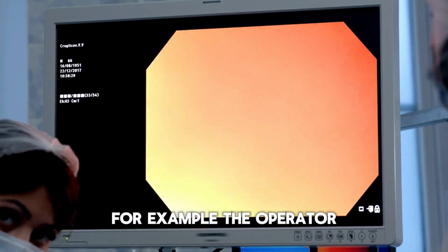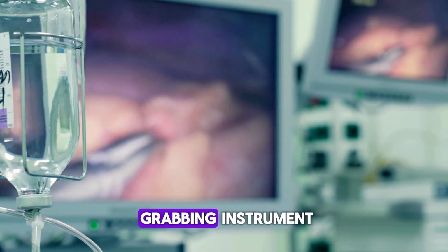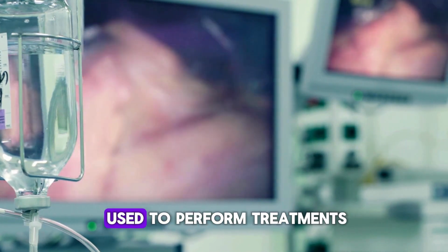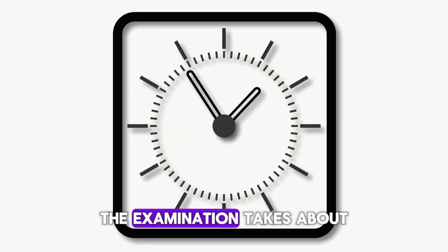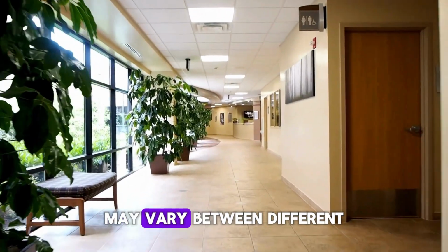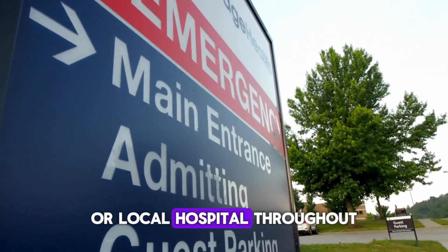For example, the operator may take a small sample, a biopsy, from the inside lining of the stomach by using a thin, grabbing instrument which is passed down a side channel. It can also be used to perform treatments, such as removing polyps or cauterizing bleeding areas. The examination takes about 10 minutes to complete. Please note that the arrangements and the way tests are performed may vary between different hospitals and areas. Always follow the instructions given by your doctor or local hospital.